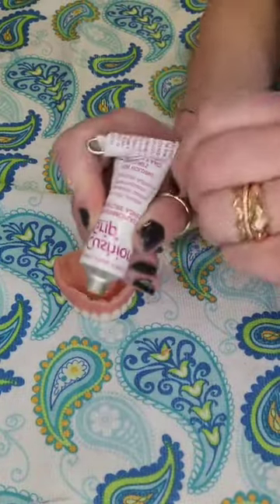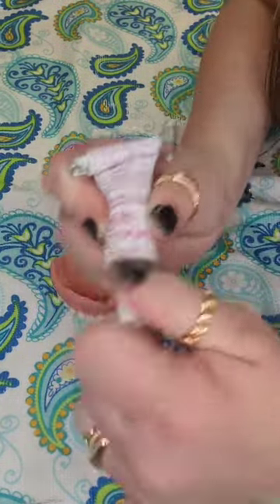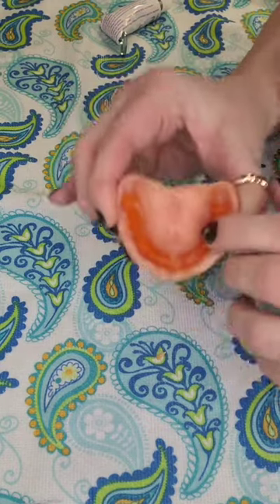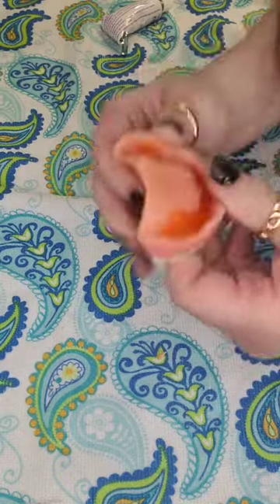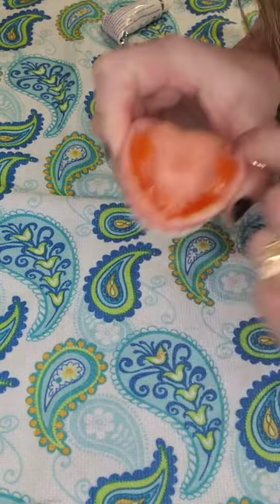Now we're going to repeat the process for the top denture. Remove the cap, squeeze the Cushion Grip out, and put that cap right back on. Roll it between your palms briskly. Mold it into your rope shape, and place it from one end of the gum groove to the other. Try not to get it too close to the back edge, or it'll seep out and possibly gag you. You may require more in certain areas. Once you place the denture in your mouth, leave it in for two to six hours while it cures. Do not eat anything for two hours. Don't soak your denture or use any other adhesives for 24 hours.